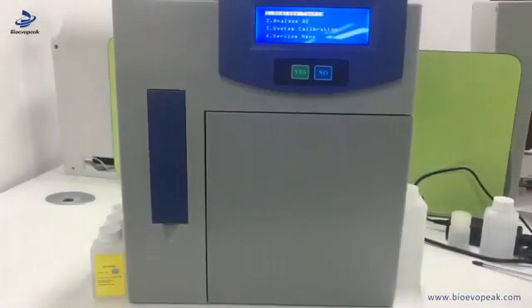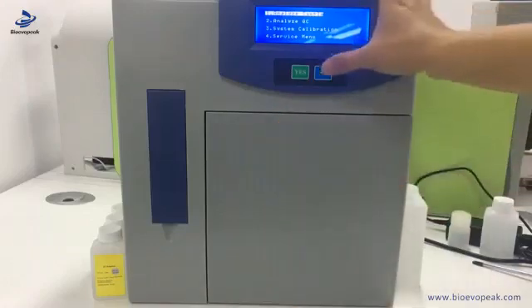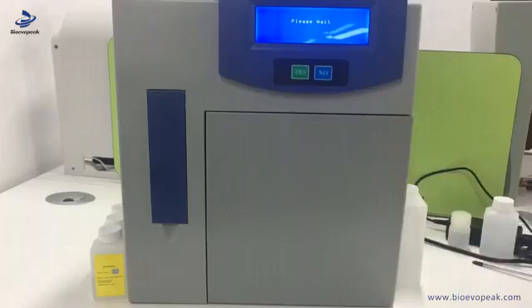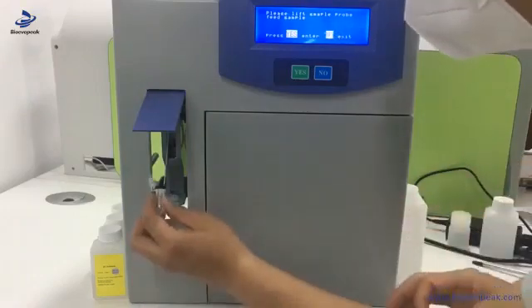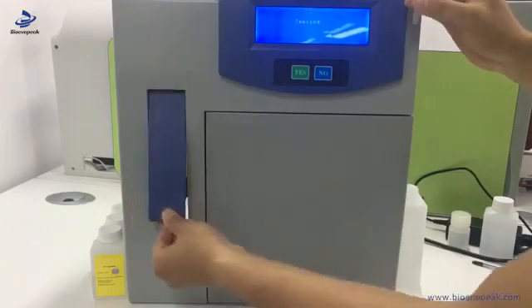Now let's test a sample. For example, this is a serum sample from the blood. Open it, then press yes to do the sample analysis. Wait for a while to let the machine prepare for testing — it will absorb some reagent from the pipeline. When it shows 'please lift the sample probe', we lift the probe and put the sample into the probe, then press yes. It will absorb the sample automatically. Then close the sample probe.